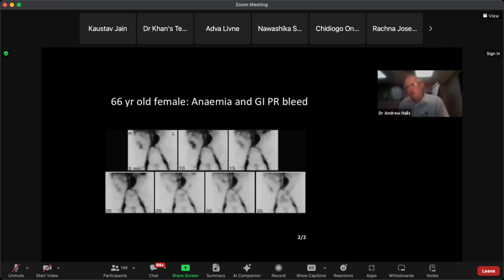So you might do that first, but if you've got somebody who's bleeding every now and again and you can't work out what's going on, this might be a good test to do because you can at least hone in on where the bleeding might be. You inject the patient, you can scan them, and scan them again 2 hours later, or half an hour later. You don't need to re-inject them. So in that kind of situation with intermittent bleeding, it's quite a good test to do.